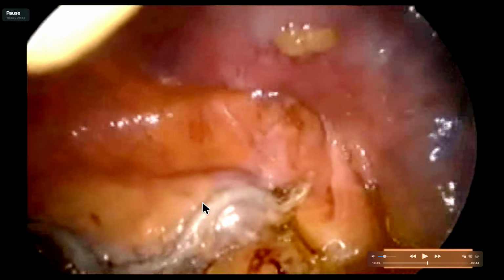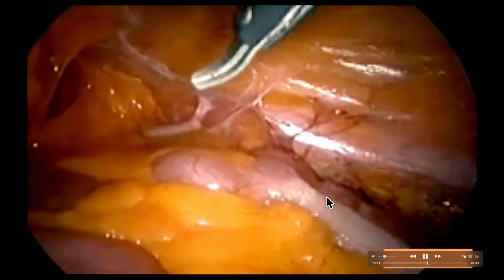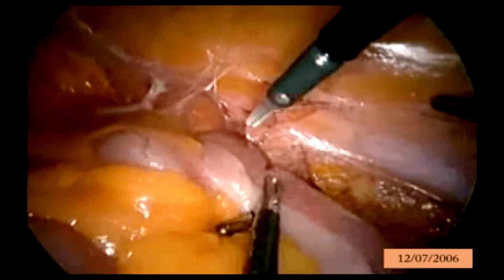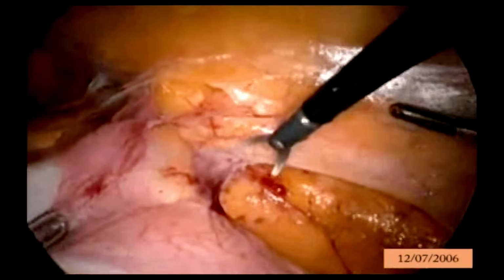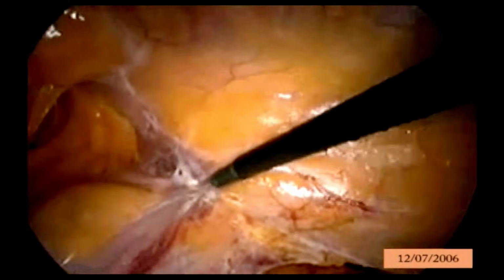Rectum. And this is what? Staple line. This is staple line. And this is rectum. And now it is easy to do further lateral approach. Why? Because distal end is free. Because it is detached from the rectum. And now this is the further.